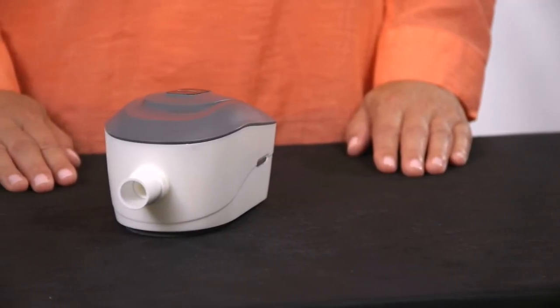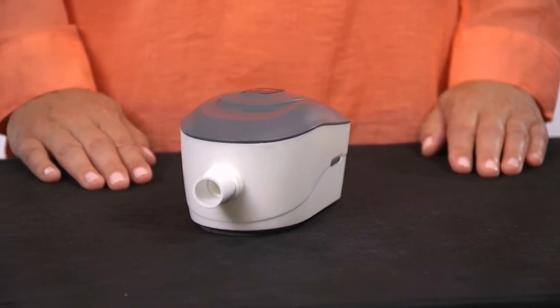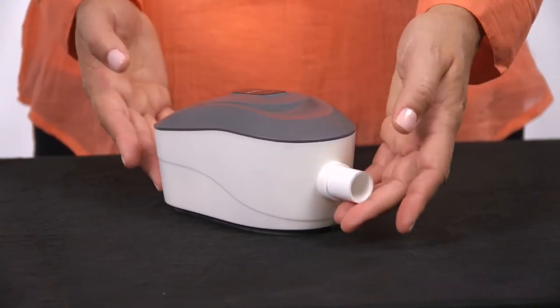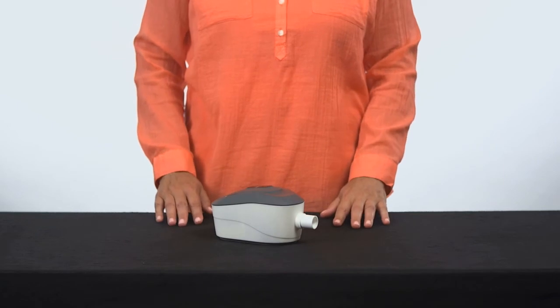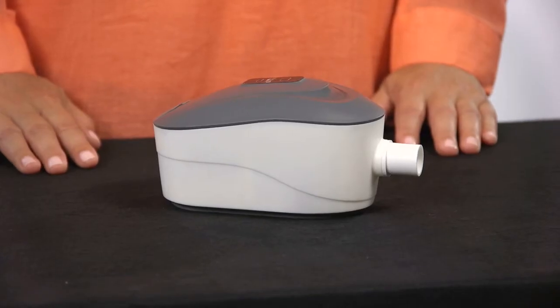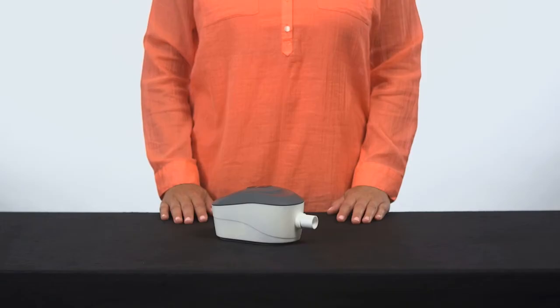The Transcend 3 is a durable, quality CPAP backed by the industry's best warranty. It comes standard with a 3-year warranty and the option to upgrade to an extended warranty and protection plan, so you can travel with peace of mind knowing your Mini CPAP is covered.